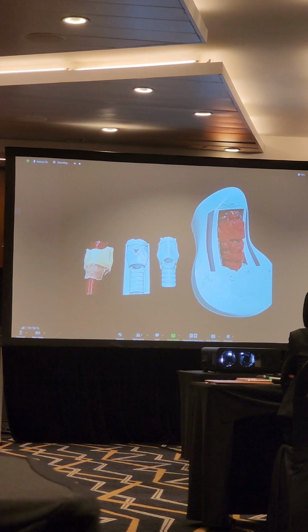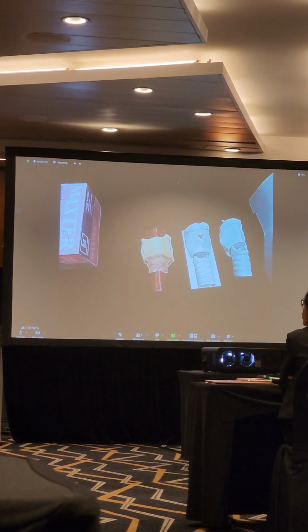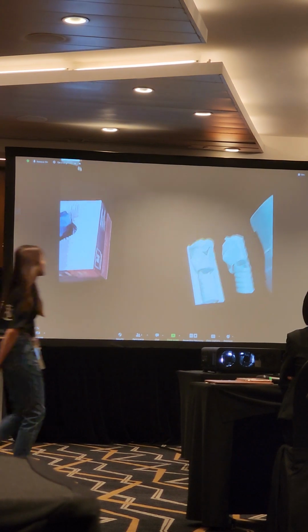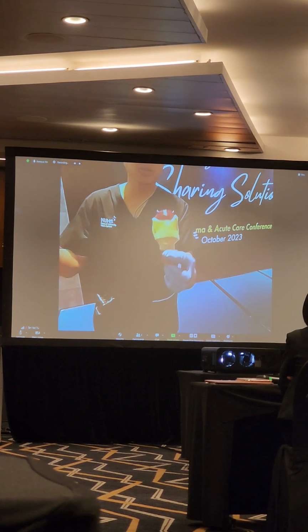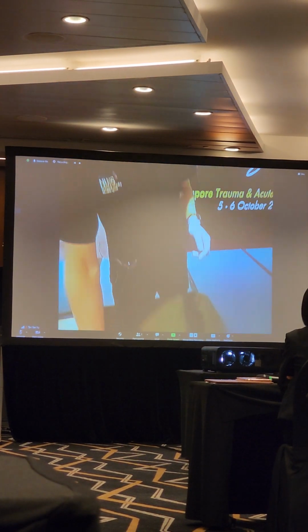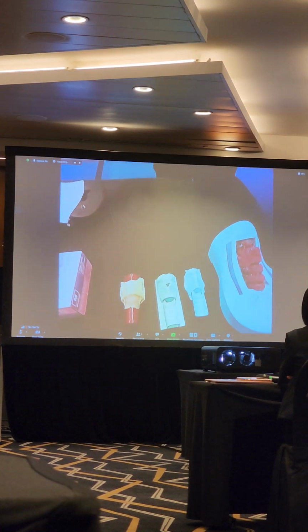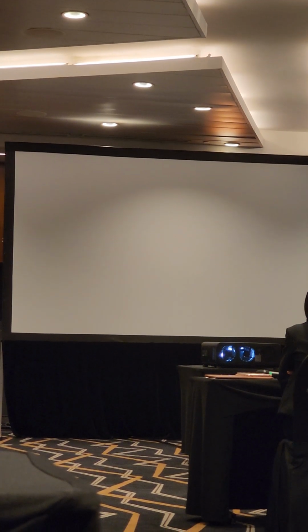If logistically it is a little bit challenging to get the correct 3D printer on board, what we can do is just print a simple 3D larynx that is also commercially available and open access. This can be placed over any of the mannequins that you have. You can place this on any of the recycled CPR mannequins or NG tube mannequins that have all been condemned.